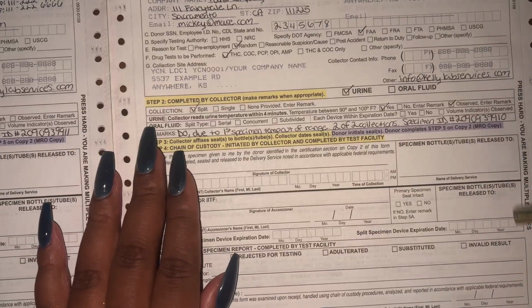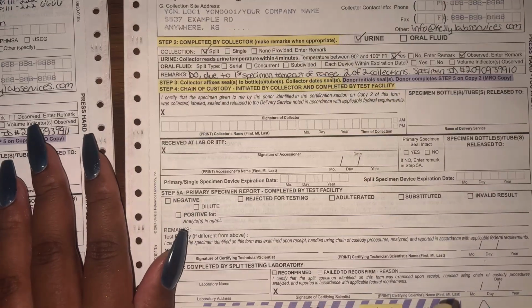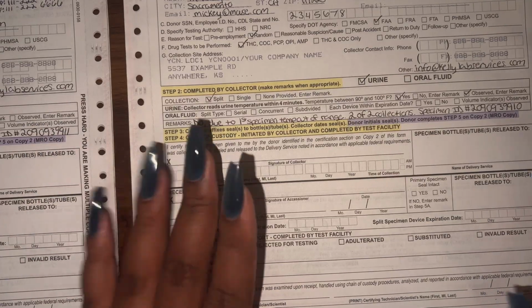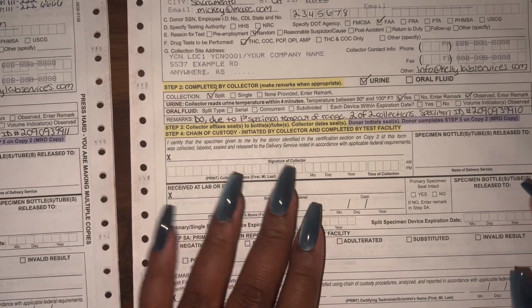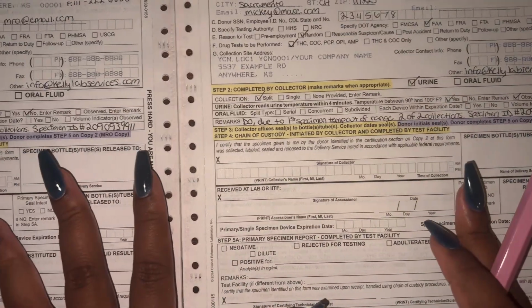Now to finish up the direct observation, you're going to go ahead and split your specimen, put your labels on, finish the paperwork, MRO copy, bag it, and then send it off to the lab. And that's going to be it for that.